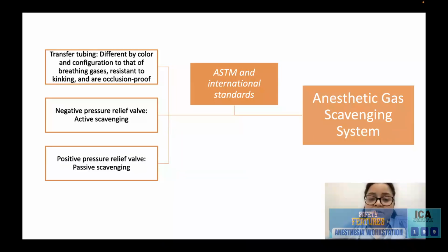In the passive system, exhaust gases pass along a tube through an outside wall or a window. Care should be taken not to position the exterior tube in a windy position, as high wind can create suction which could be transmitted to the patient.